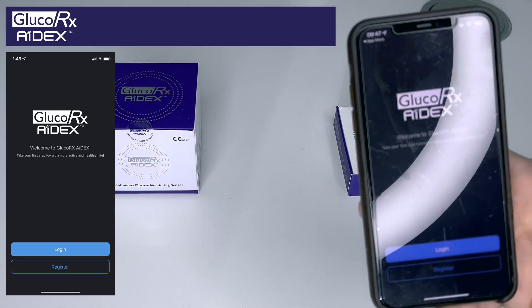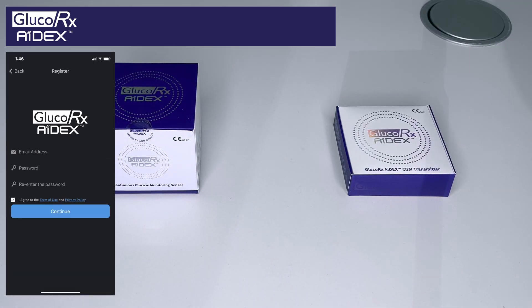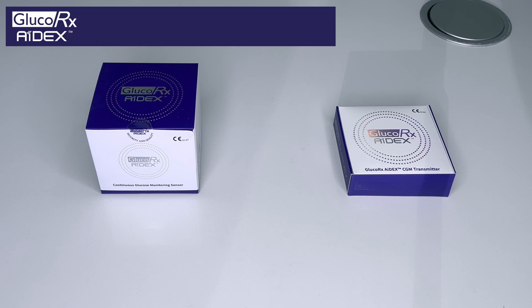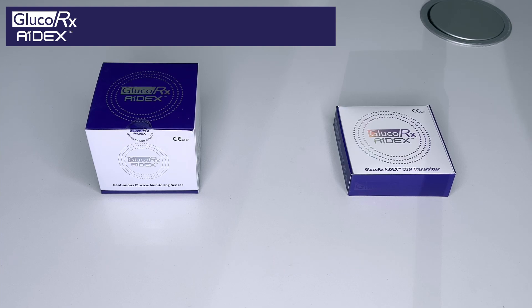Once downloaded, you need to register. So you set yourself up an email, a password that you can remember, re-enter the password, and then that will send an email straight to your email account just for you to verify, to ensure that it's all nicely secure and it's definitely yourself that's setting up the account.